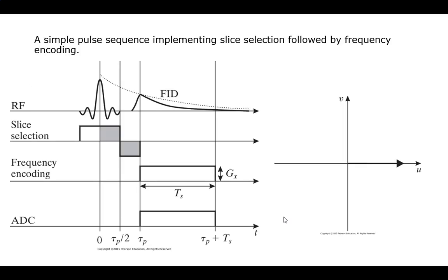All right, so let's start talking about some of the pulses in a little more detail. This is probably the simplest sequence you can imagine. This is your simple FID reading, things of that sort. There's no echo, anything of that sort happening. Remember, the slice and frequency gradients at the moment are basically encoding your spatial location.